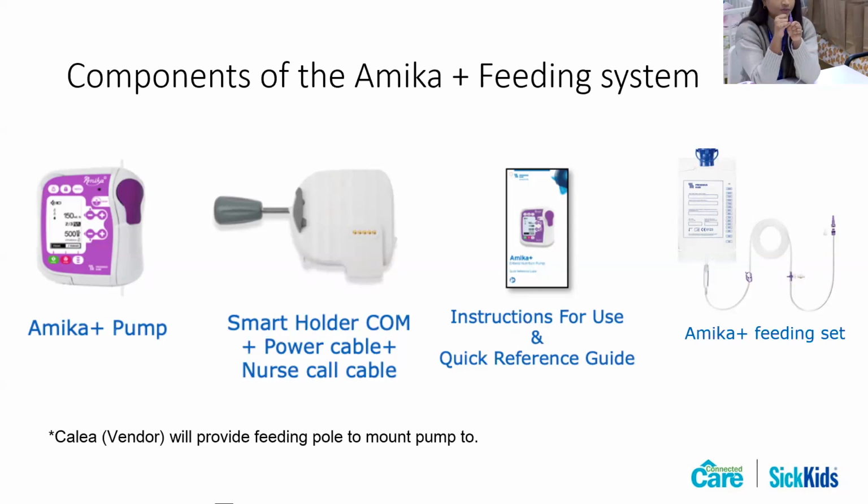This is our clamp. And moving along at the end here is this connector piece, which then gets connected to the child's feeding tube. This connector piece would not be able to fit into an ENFit feeding tube. So the majority of the children that are in the community have an ENFit type of feeding tube. And so for this feeding set to be connected to the child's feeding tube, essentially you will just remove this connector piece like so by just untwisting it. And now this piece can be attached to an ENFit type of feeding tube. So then you just twist it on like so. So now this can be used for an ENFit type of feeding tube.